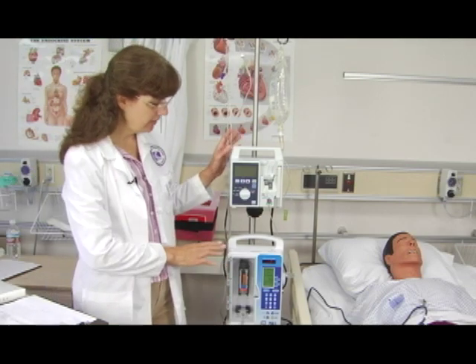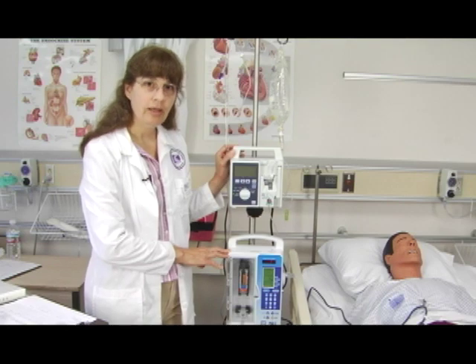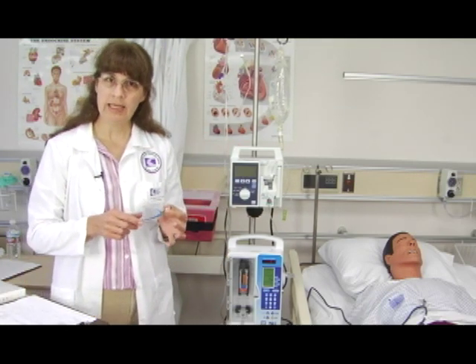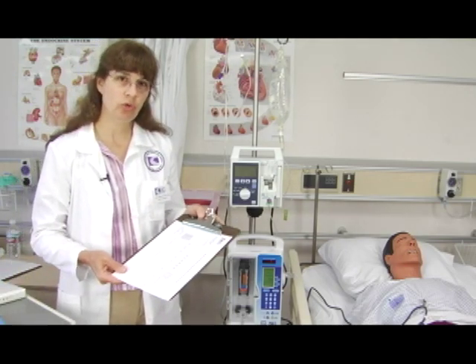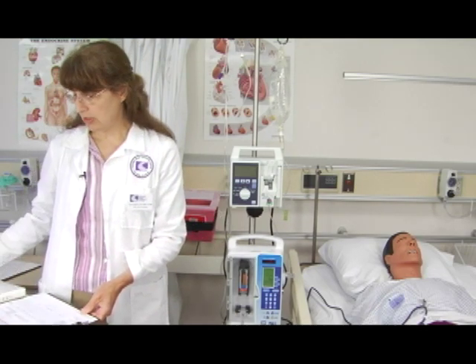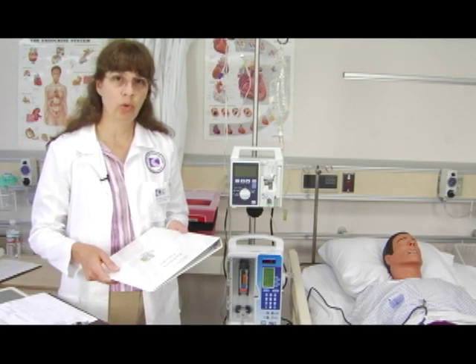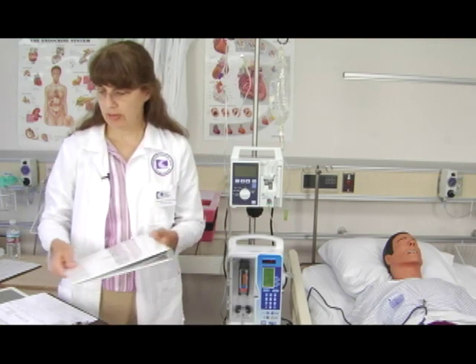This is the equipment that you're going to need for the setup. We have the PCA pump that we've set up with medication already in the medication room. You will need the PCA key, which opens the pump, and you will need your patient-controlled analgesia record, which is a form that your facility supplies for documentation purposes. You'll want your patient's chart so that you can compare the orders with what you are actually administering to the patient.